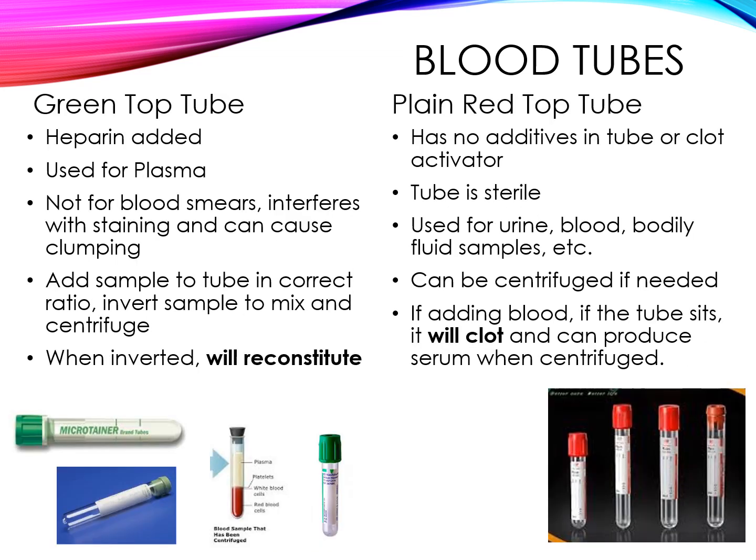Two other more common tubes you may see are the green top tube and the plain red top tube. The green top tubes are commonly used for chemistries, for exotics, and other specialty tests. There is heparin in these tubes, and as you may know, heparin is an anticoagulant, so it keeps the blood from clotting. So when you keep the blood from clotting, you have whole blood. So that means when you separate out these green top tubes, you get plasma, not serum.